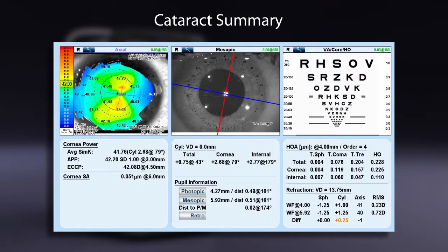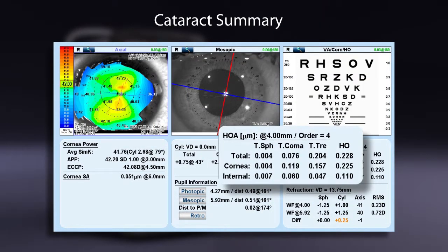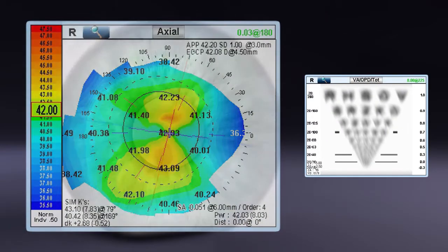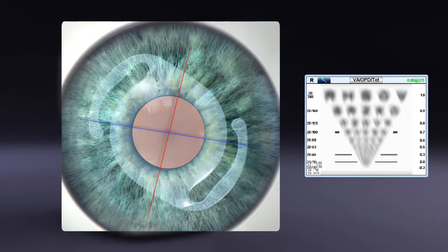Cataract summary displays any high-order aberrations that may remain after the cataract is extracted. Map view shows pre-op measurement with the ability to display the post-op measurements showing the correction along with the markings of the toric IOL in the retroillumination image.